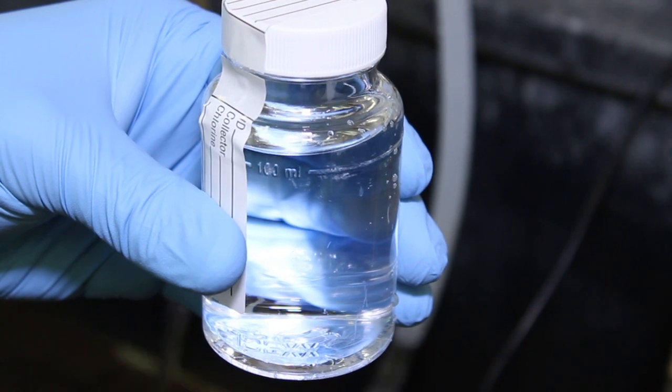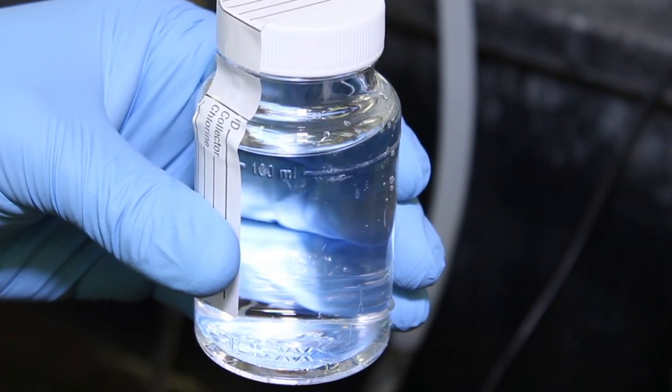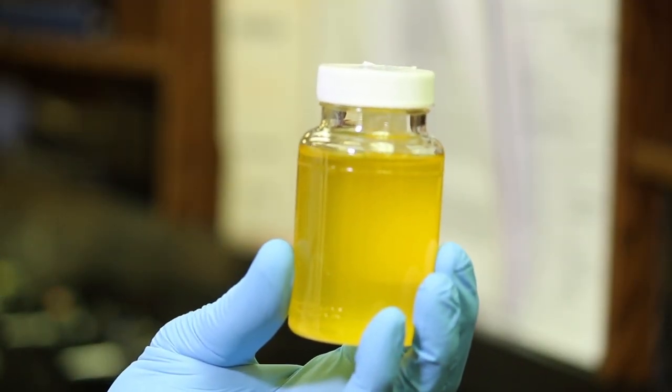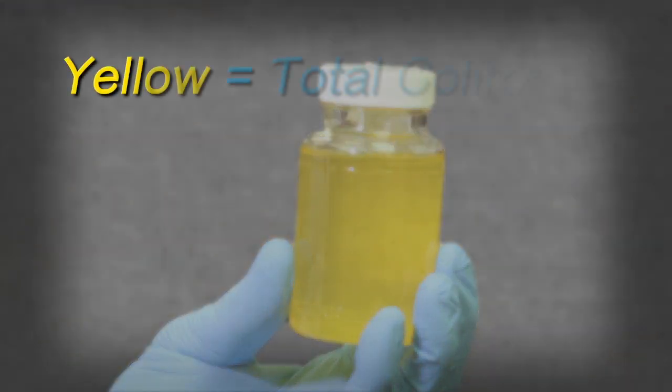If a sample vial's contents are colorless, the test is negative for total coliforms. If a yellow color is evident, the sample is positive for total coliforms.